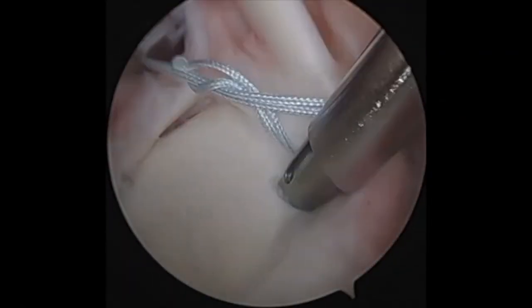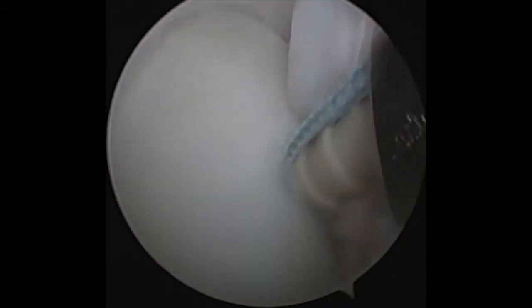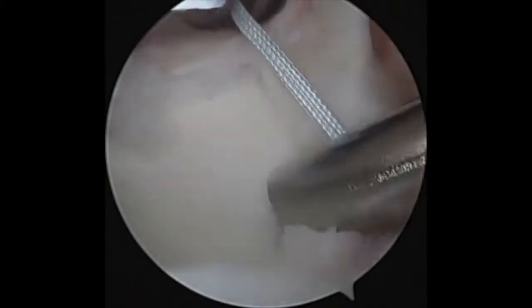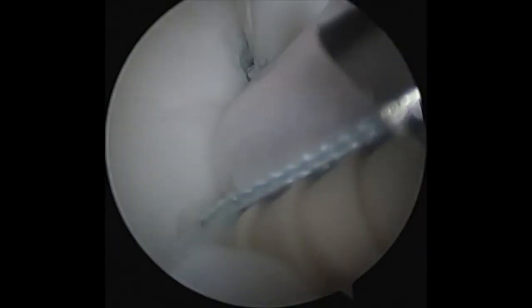I then drill a pilot hole through the Percutaneous cannula, retrieve the suture and load up the PushLock, and then impact the PushLock in. I repeat it again to make a second anchor to repair the posterior SLAP tear. Again, I'm looking posteriorly using the Percutaneous cannula.